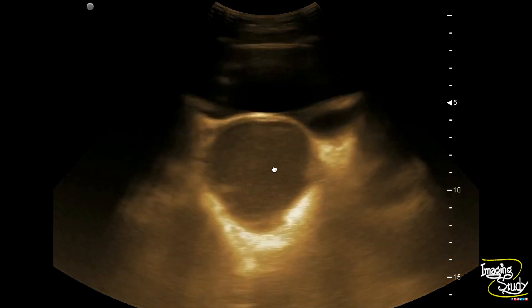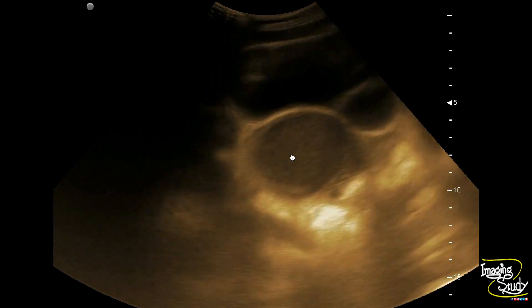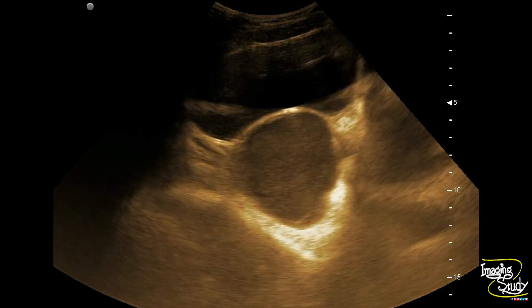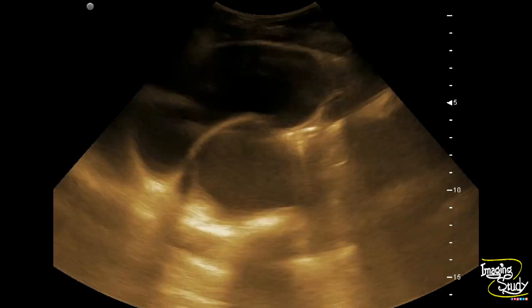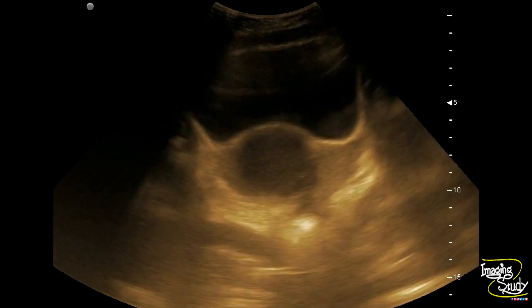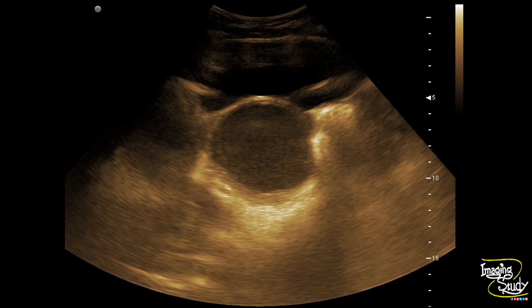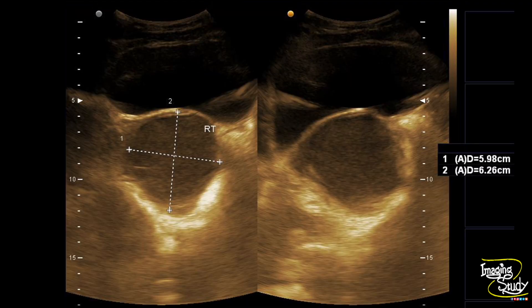You can also see some fine low-level internal echoes within this, so this is a case of endometrioma or chocolate cyst. Here you can see the endometrioma — the echogenicity is more than the adjacent urinary bladder lumen.